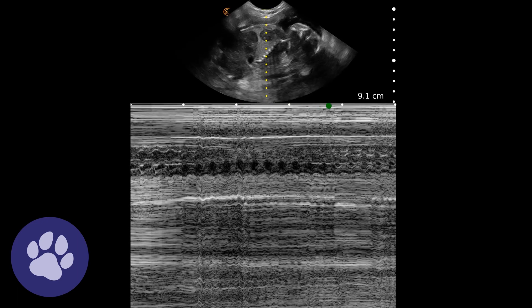Frequently when we're scanning puppies we might be at the point where they are ready to be born, and we want to be able to make the decision about whether they need to have a caesarean or not. One of the aspects of that is assessing whether there's fetal distress, and we want to be able to get a heart rate — we can do that with ultrasound.